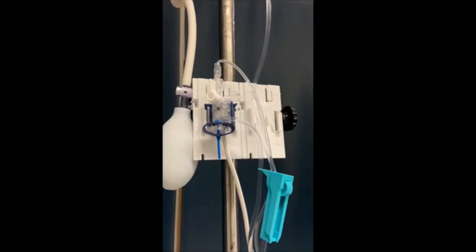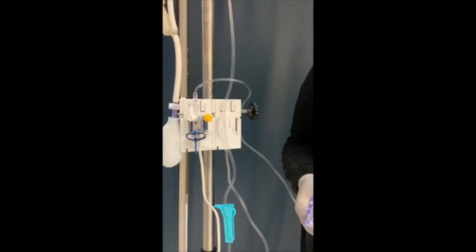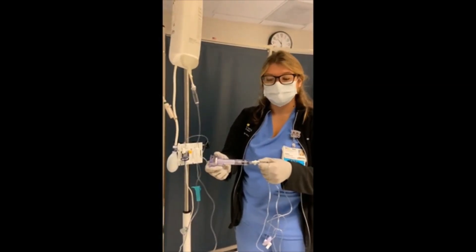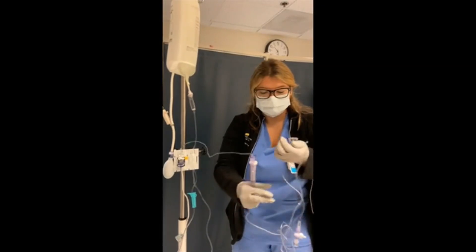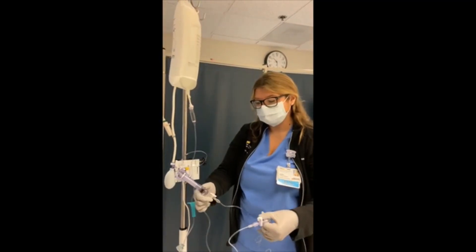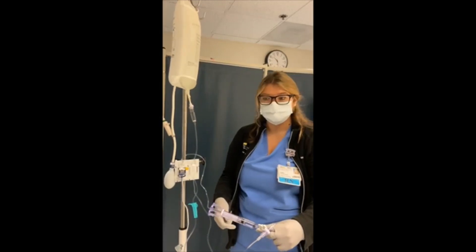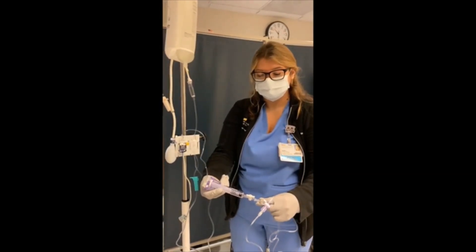Place the yellow non-vented stopcock. To prime the remainder of the IV tubing, open the safe set syringe by pulling back on the syringe. Ensure all your stopcocks are open to the patient. Pull the pigtail to allow IV fluid to flow through the remainder of the IV tubing. Return the safe set syringe to the lock position. Ensure no air or bubbles are present in the IV tubing.